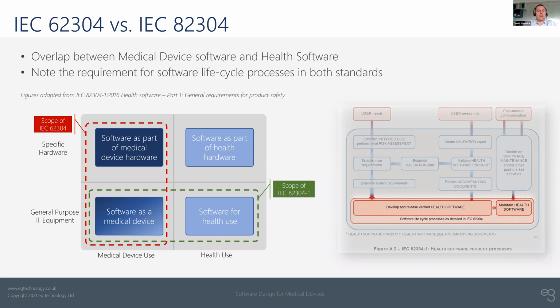What you'll see here is that there's a certain amount of overlap. So you have software which, I guess, the traditional view, software that is part of a piece of medical device hardware, whether that's a handheld or a big piece of lab equipment or something like that. It's software that's been written bespoke to go along with some hardware. There's also software as a medical device, and that's becoming increasingly popular, and there are lots of new bits of software coming into the market that have a very specific medical purpose.